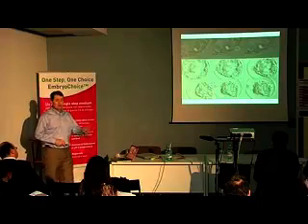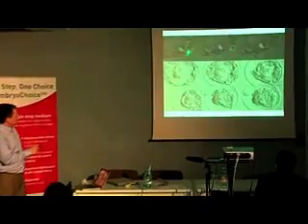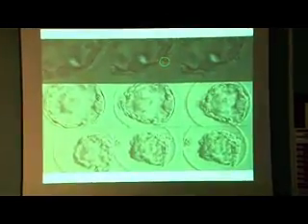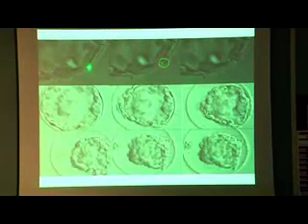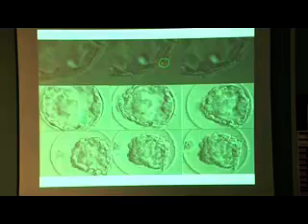So we introduced a procedure called artificial collapse or artificial shrinkage. What you do here is you look on one side of the blastocyst and you find a nice clean area between two trophectoderm cells, and you line up a little laser right here and you fire a shot to disrupt those junctions between the two cells. So you make a little hole right here, and all this fluid in the embryo leaks out through the hole, and you can see that the embryo is collapsing down on itself towards the hole. And now that that fluid's gone out of the center, this embryo vitrifies much more efficiently.